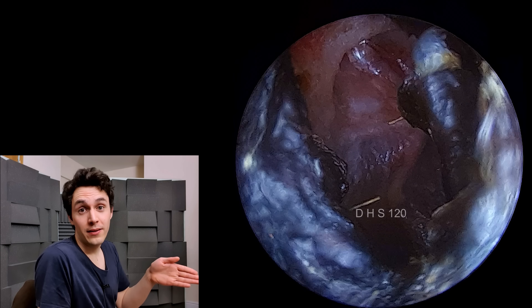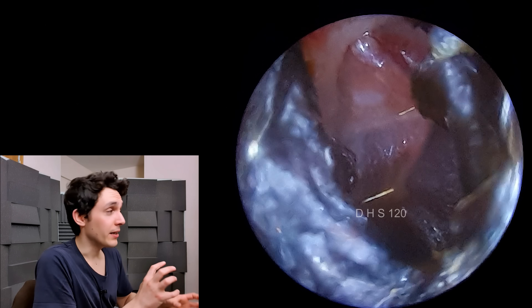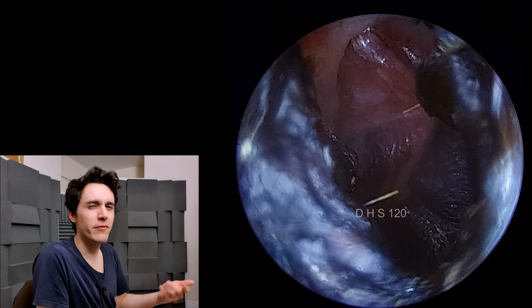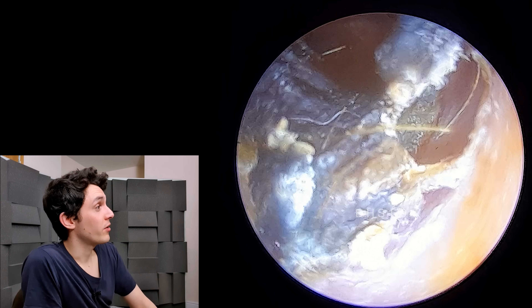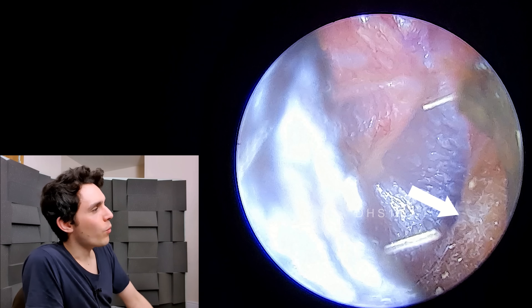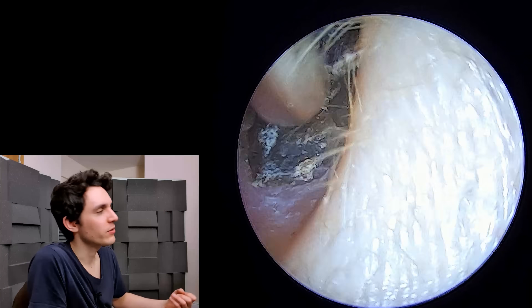There's also a fungal infection back there which is lurking just behind this debris. I'm just adjusting the light here — typically if you ever see me adjusting the exposure settings, I'm trying to look through a gap or look at an area of darkness. That's one of the advantages of using an endoscope. You can see the fungal debris — all that white furry stuff growing on the ear canal. We call that the hyphae of the fungus — these little white filamentous, wispy bits.